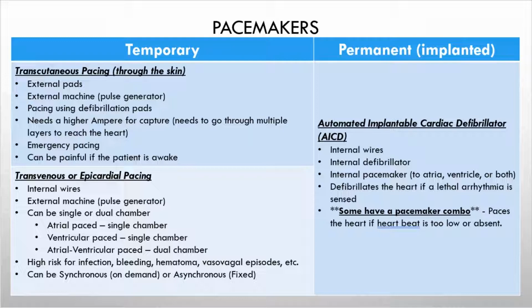The temporary pacemakers, there are two types. There's the transcutaneous pacing, which is more for our emergency pacing. These are the ones that use the pads from our defibrillator, and the pads from the defibrillator, aside from the ability to defibrillate, can also pace. The only trouble is that because the electricity needs to go through the skin, the bone, the fat, and the muscle before it reaches the heart, we need a higher amount of energy. And if the patient is still awake, it could be quite uncomfortable for them.